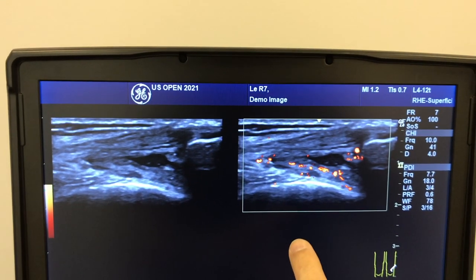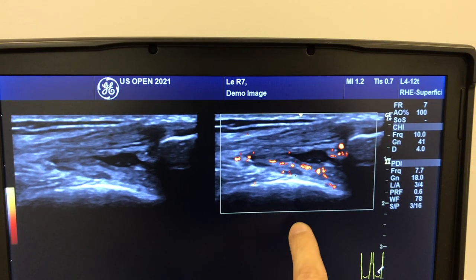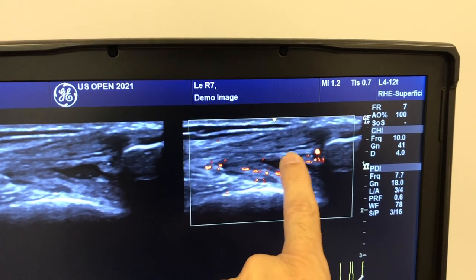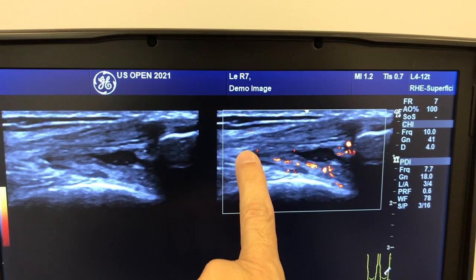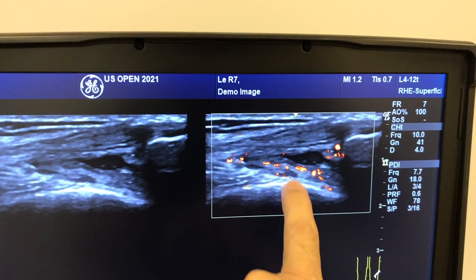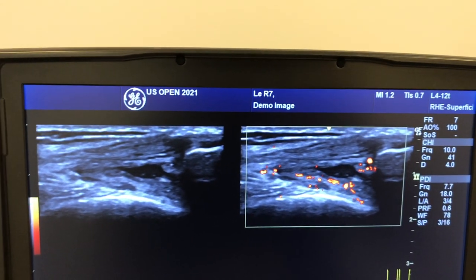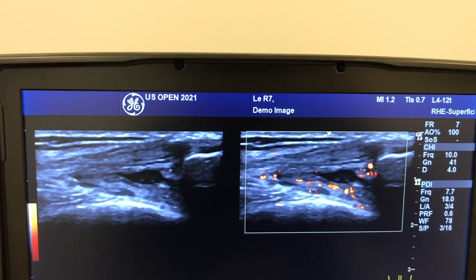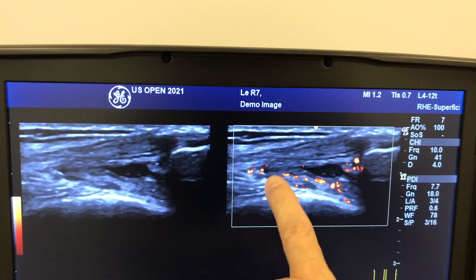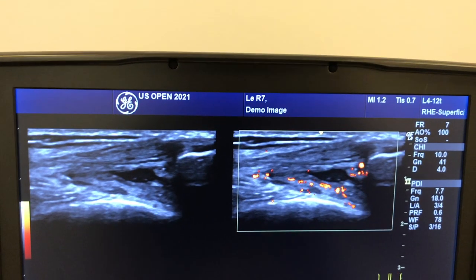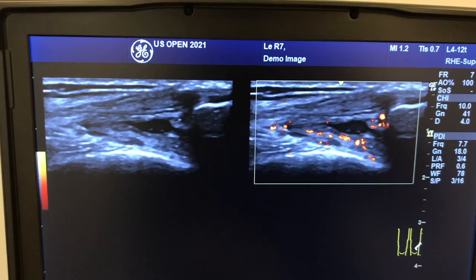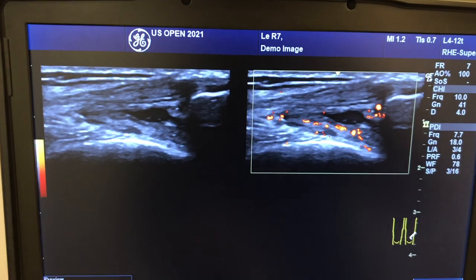The symptomatic knee on the other side does show a small amount of fluid, but it also shows a lot of red color indicating hyperemia and inflammation. So this knee has synovitis around the joint effusion, and it turns out that it was the symptomatic knee.